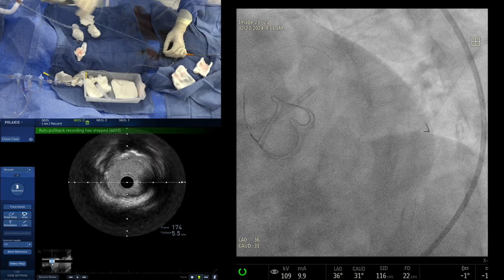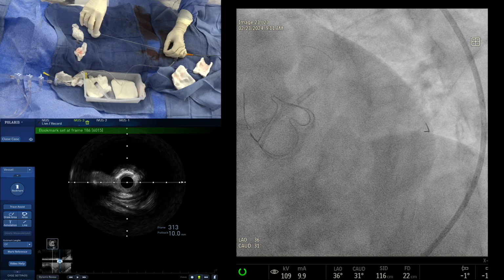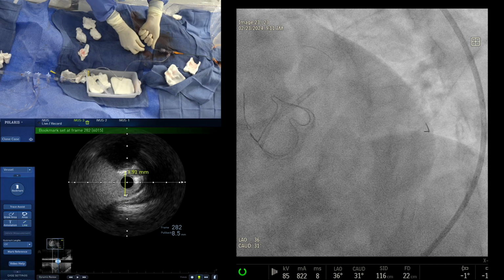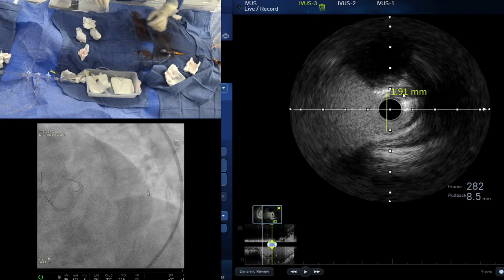And okay, how does the circ look now? Guys, comment on it. Circ actually looks very good. Yep. This is the ostial circ. Actually, there was no calcium in the ostial circ. It was just distal left main. There's like a 90-degree calcium at the ostial circ, like a nodule. The pre was like 1.5. Now MLD is 1.9, like the surface of the nodule is a little bit shaped.